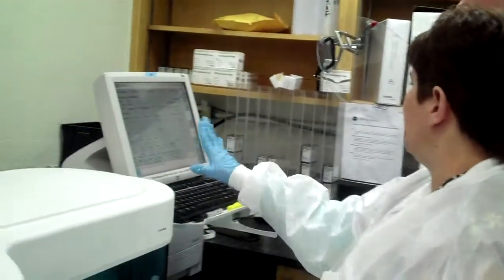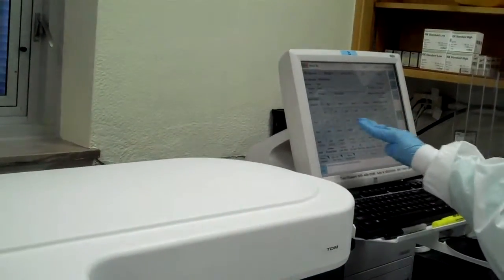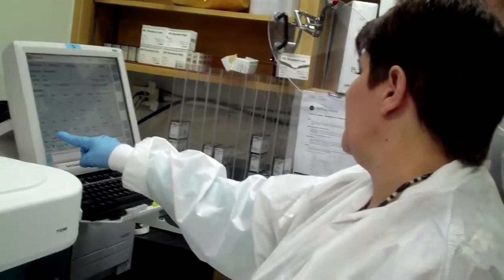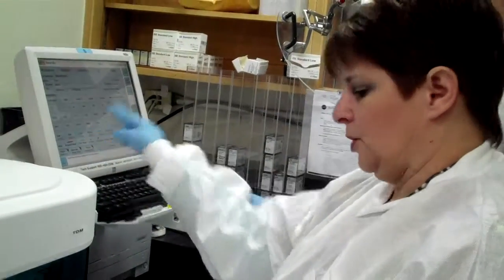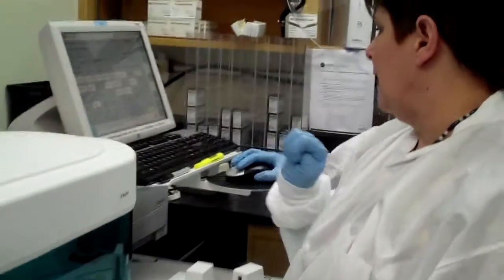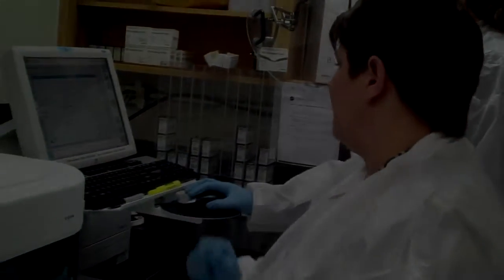Okay, it brings up your menu. Here's all the things you can pick from. There's all the individual tests, but for convenience, we have compiled it down here into a basic metabolic panel, a comp, a liver, a renal, and we're going to choose a comp because that's what they want. Okay. Now go to demographics. Okay, just click on the name field. We're just going to put education.